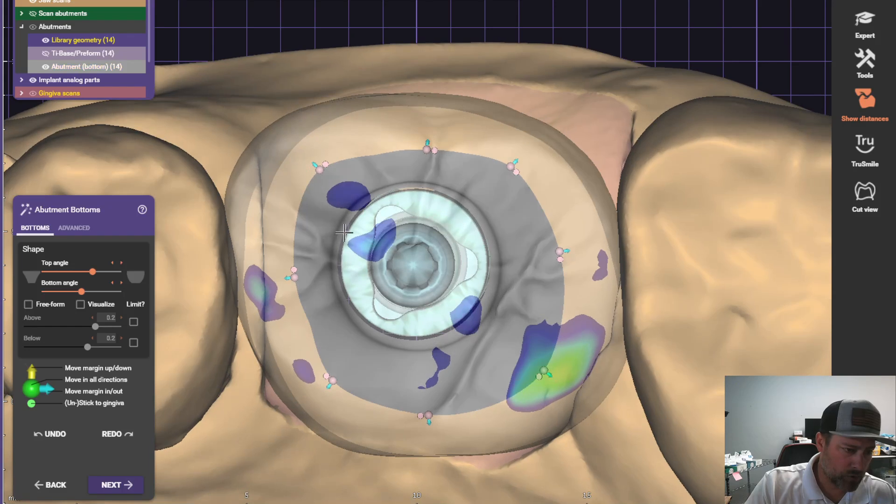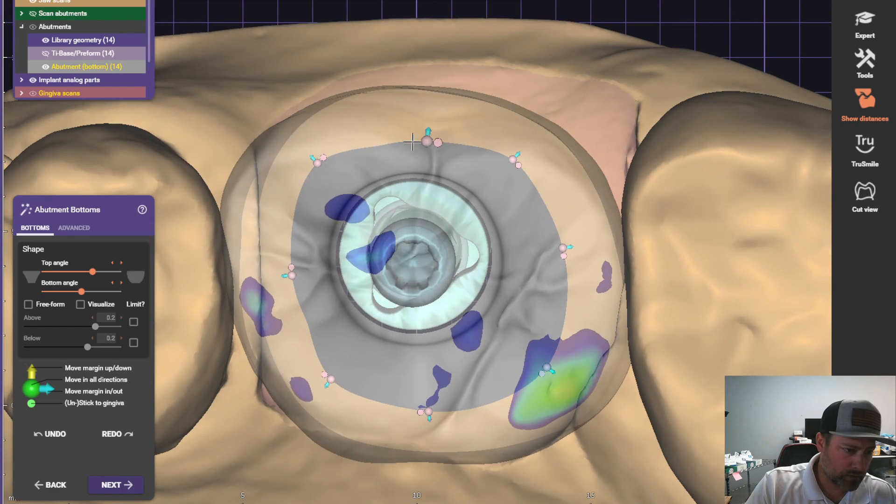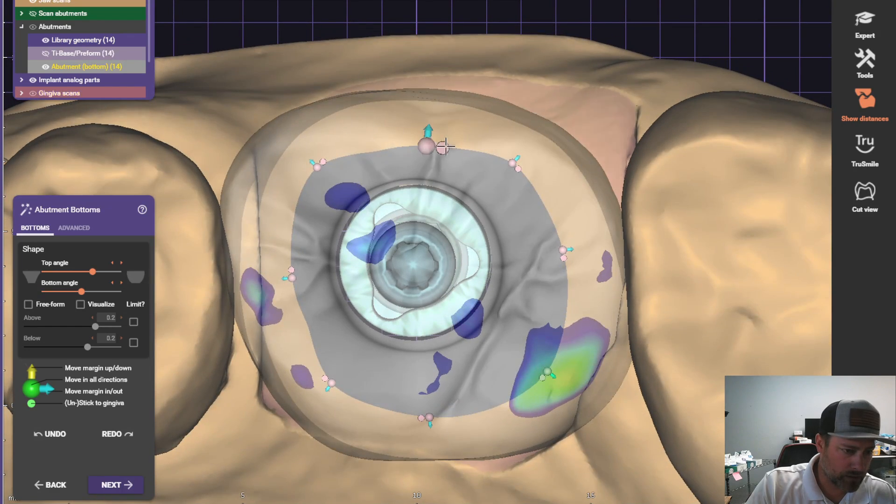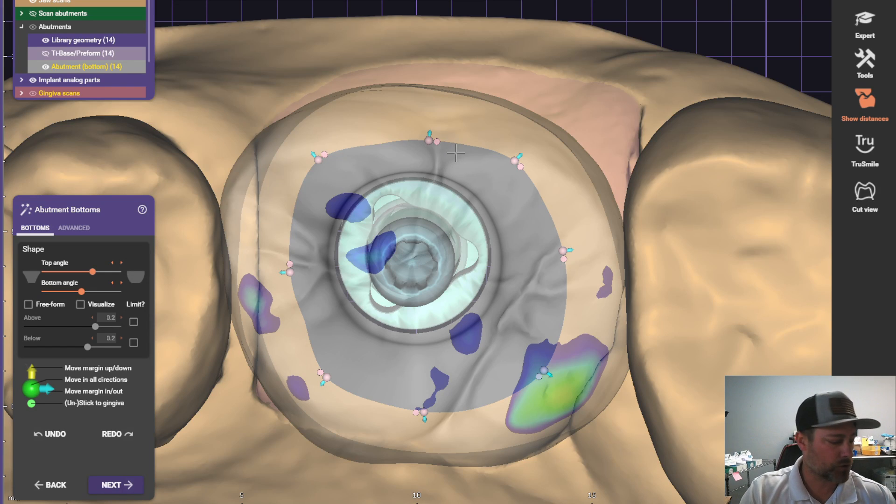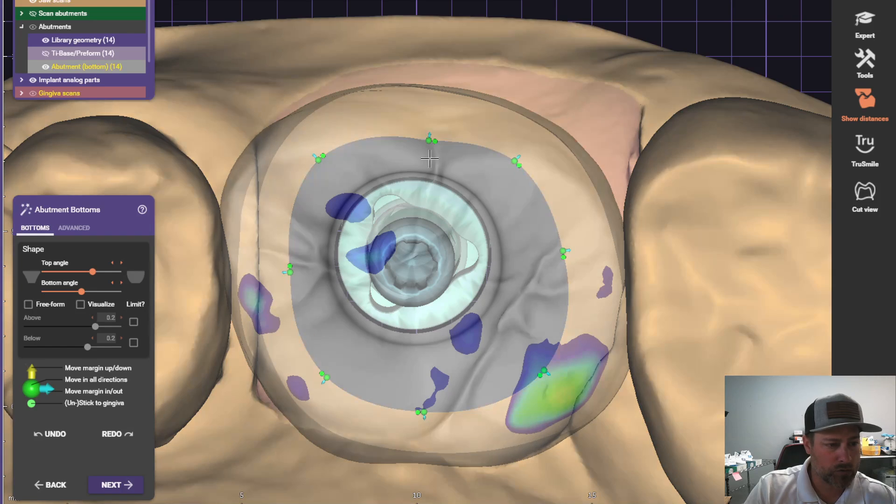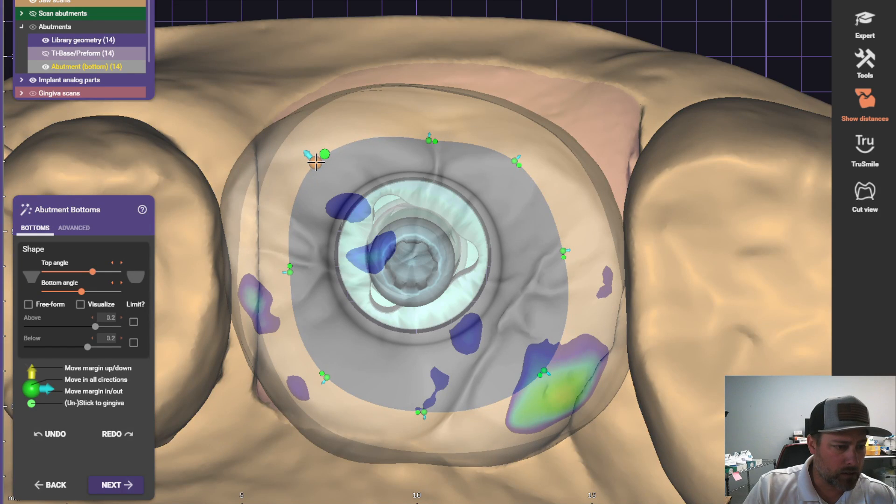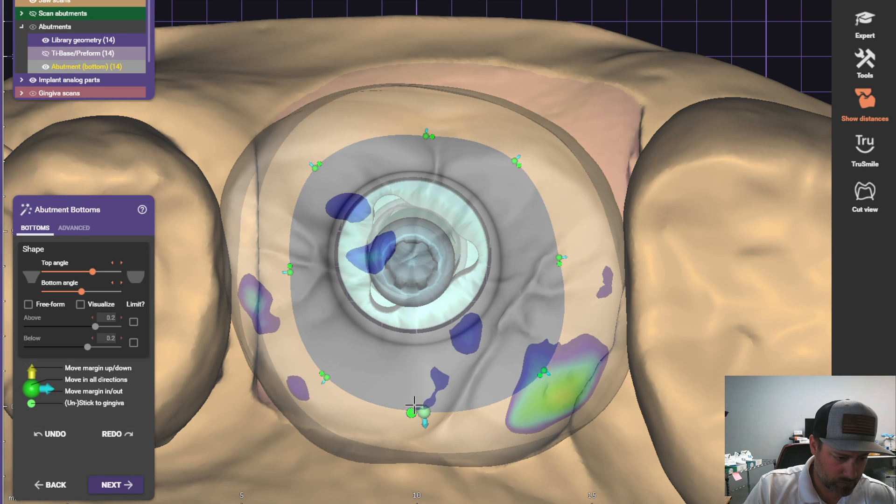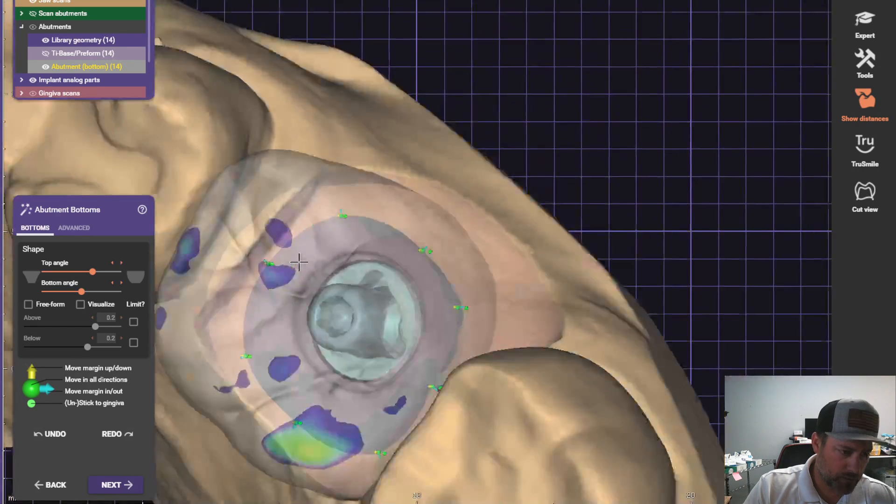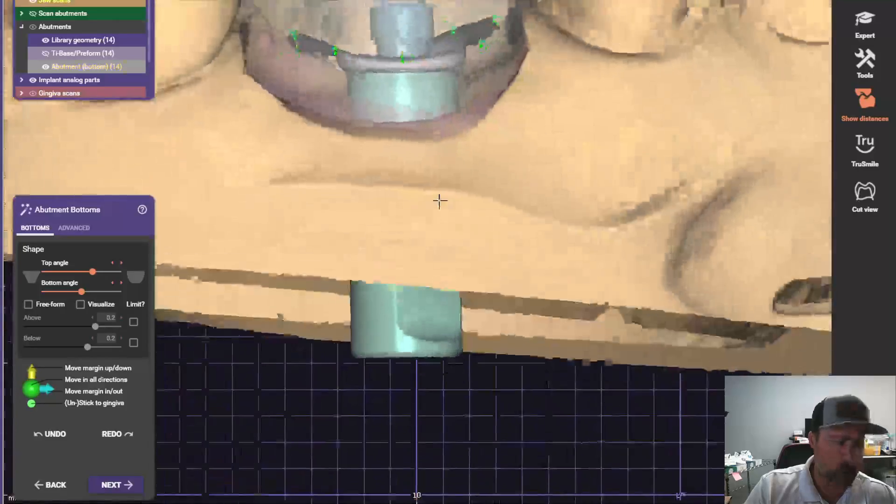Okay, don't worry about how ugly this looks right now because when we detach it from the tissue, it'll straighten everything out. You just hold down control. And then it straightens it down. And you can kind of do some minor adjustments here. Okay, now this is going to be a titanium abutment, so we need to drop the margin.